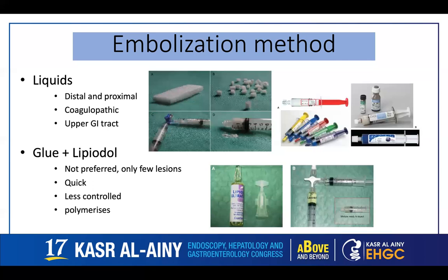And the other one, which is a liquid, is glue plus Lipiodol. It's not preferred to use it in GIT bleeding, only in a few lesions. It has the merit of being a quick embolizing material, but it's less controlled.